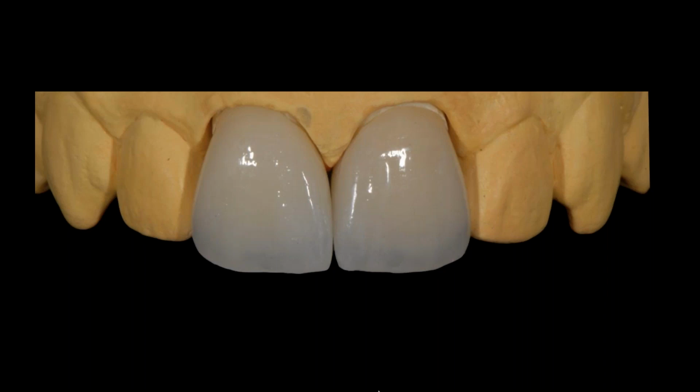You think, oh, this looks better. It's so much more translucent. But remember, I was going for an A1 shade. And in an A1 shade, a lot of translucency does what? Lowers the value. I didn't get that opacity on the inside to support my dentin.